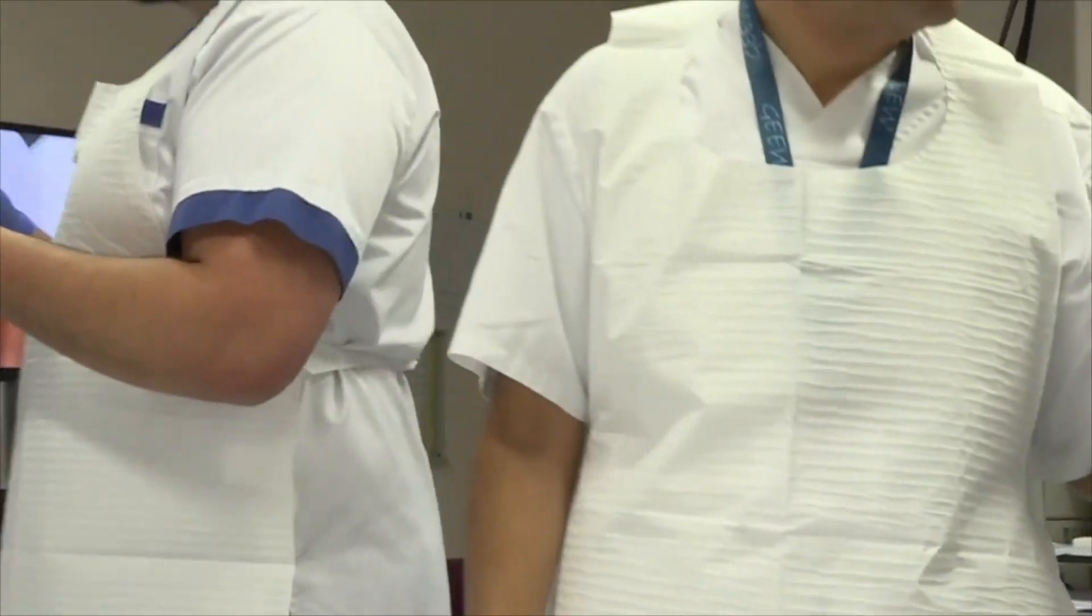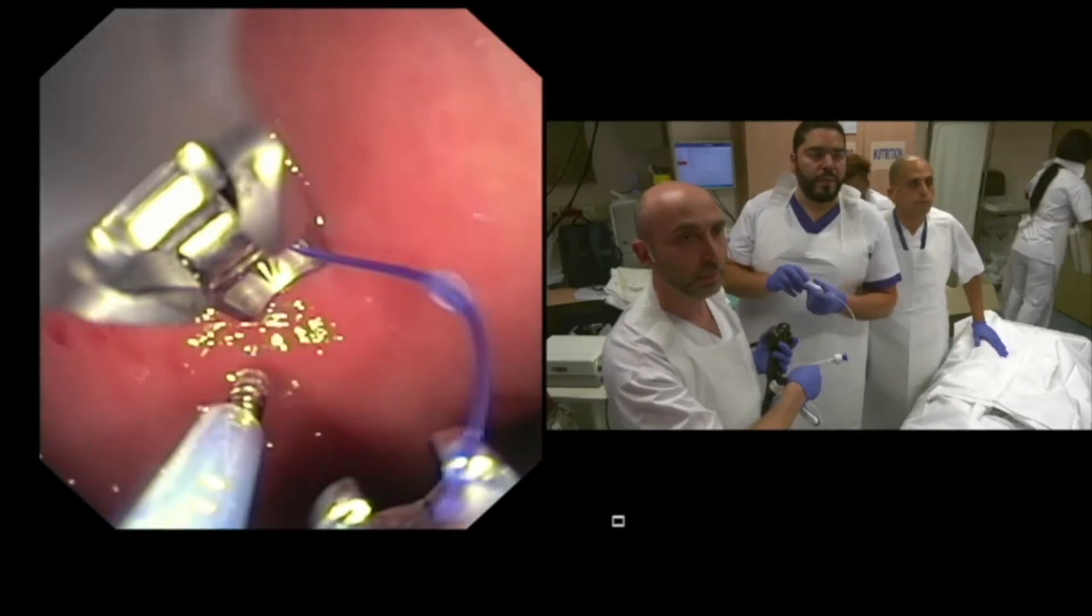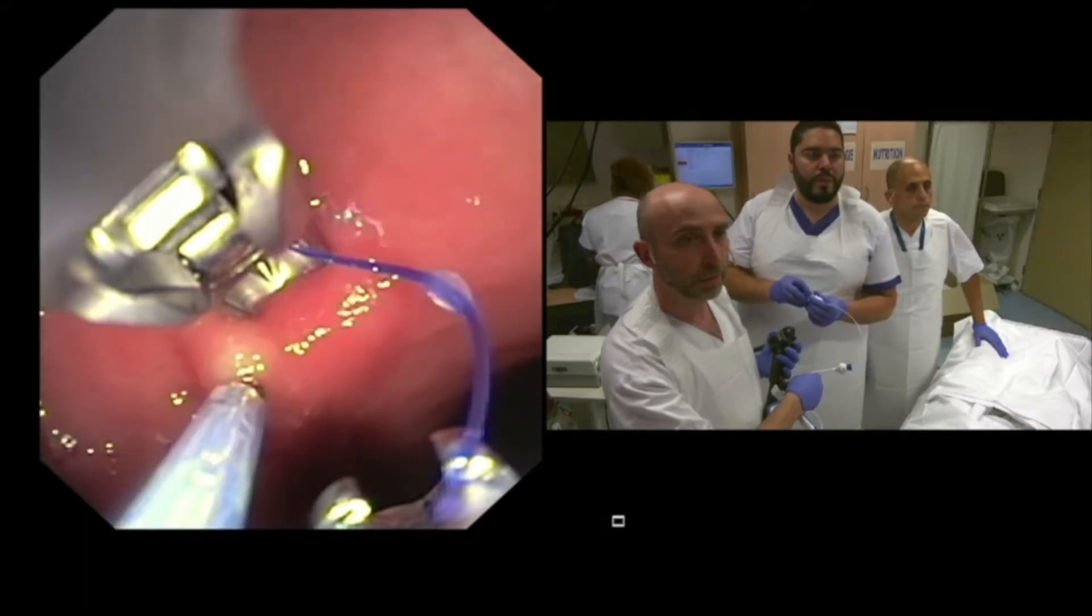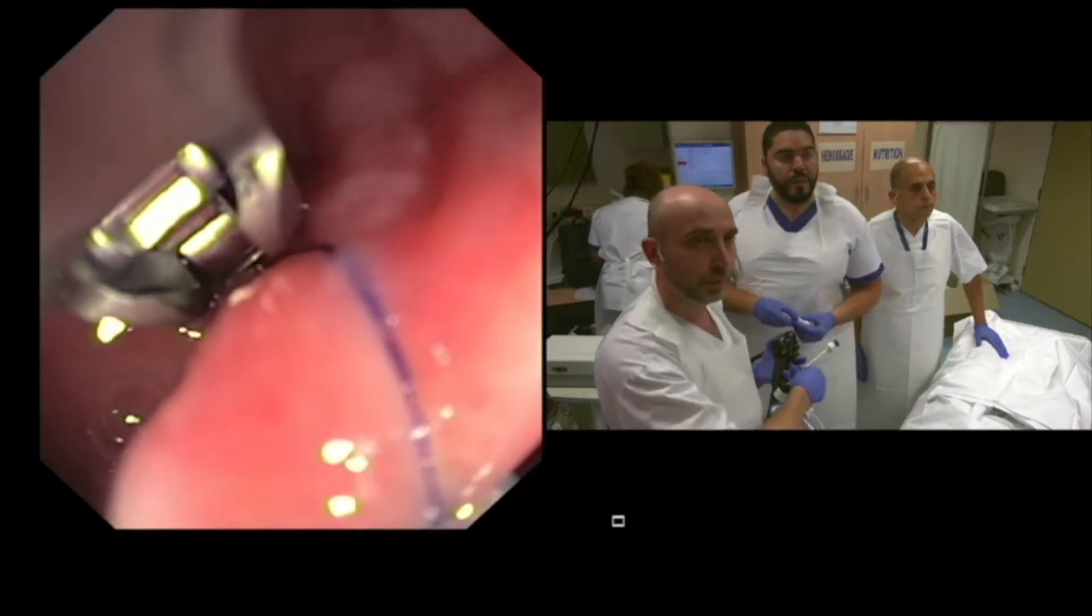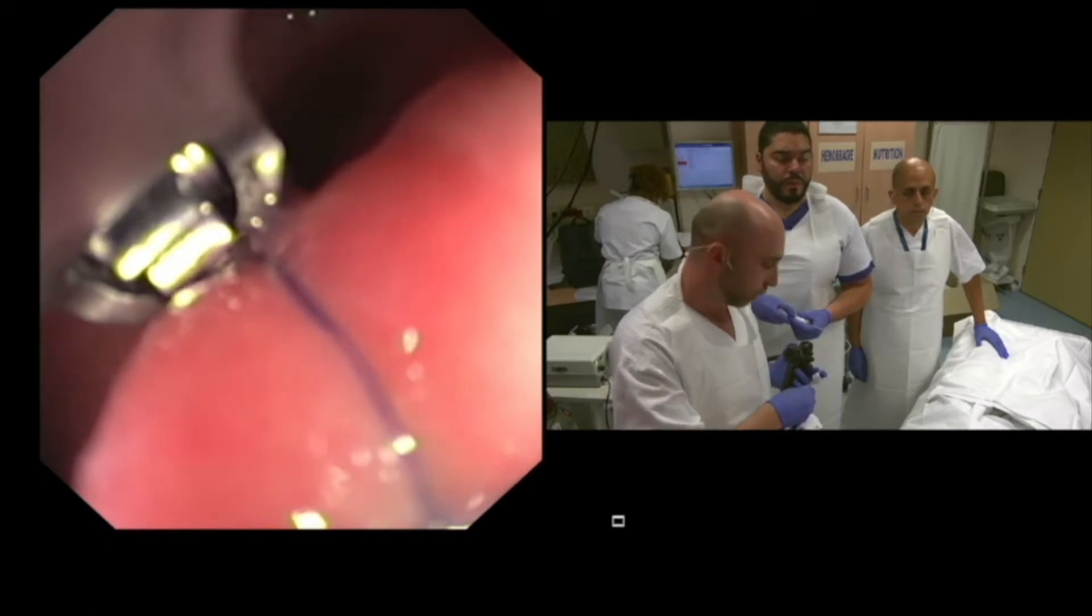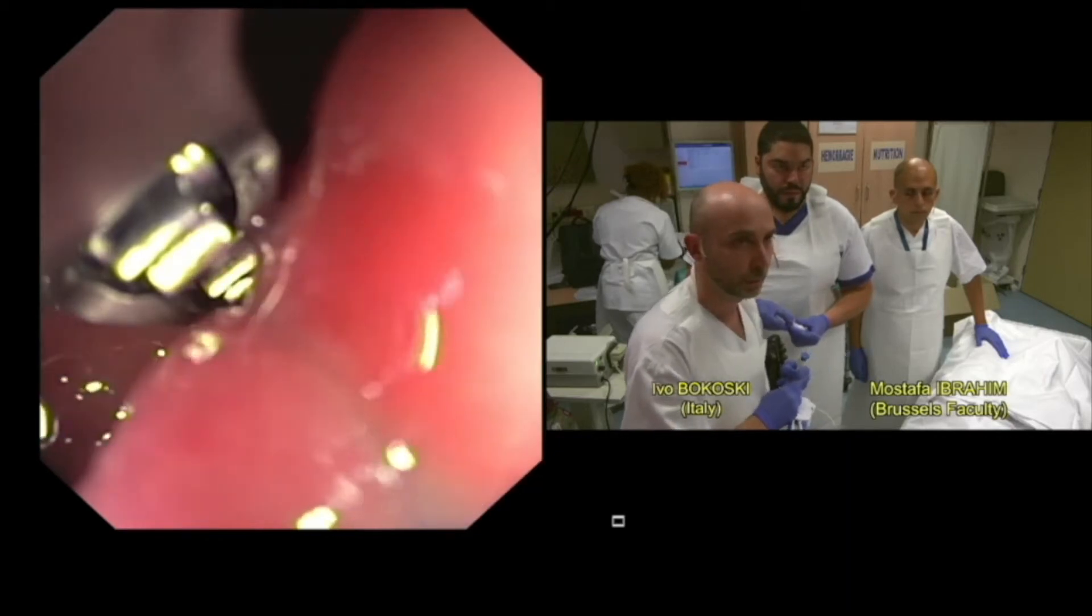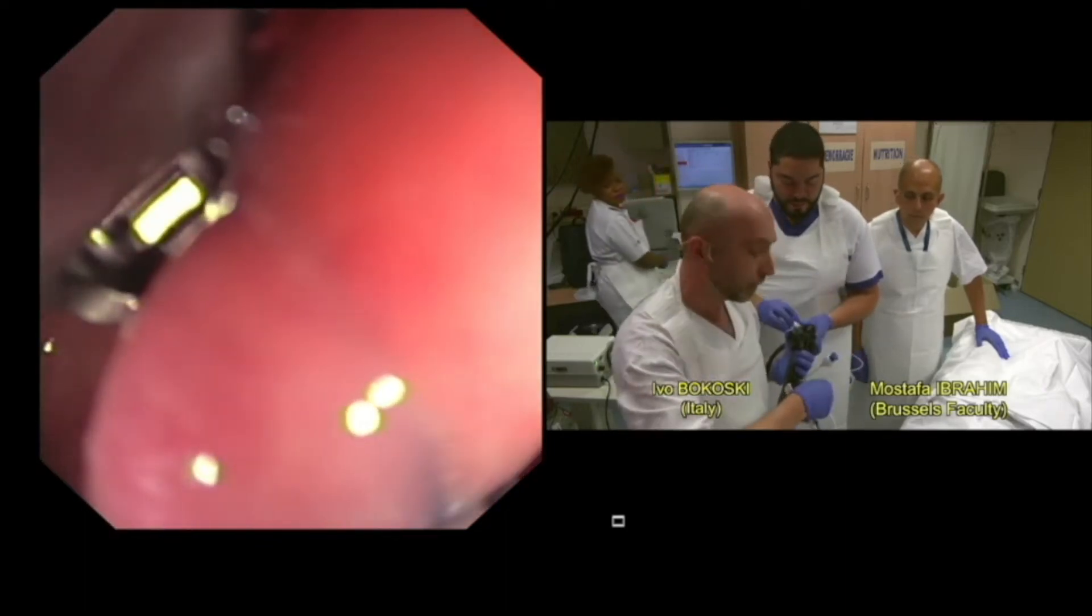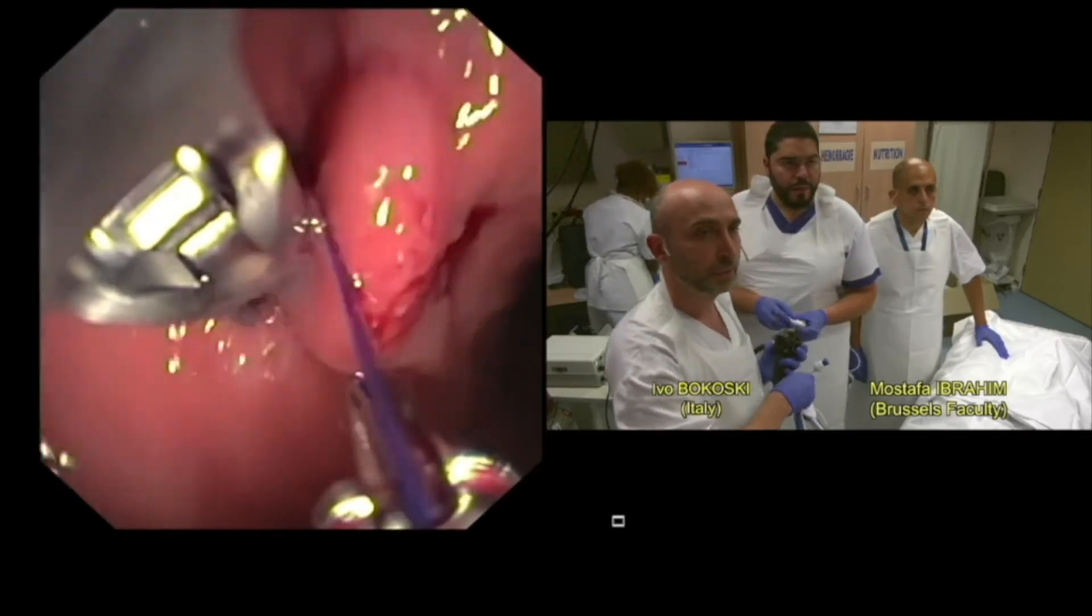Now we will start suturing. I will ask Youssef to open the Helix. This is the site where we usually start. Please do three rounds. I am asking for three rounds because with this device you can easily go on the other side of the stomach, in the outside organ. So I close now, push and pull the needle. I can also hug the scope. Now I have the needle back. Unroll please. We are free. And the first suture has been placed.